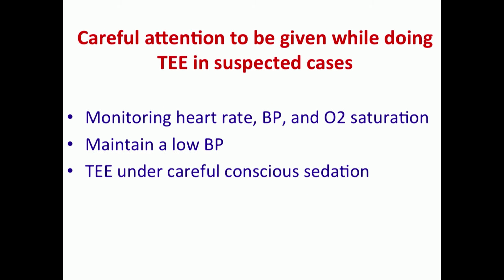And while doing the transesophageal echo, utmost care should be taken by monitoring the heart rate, blood pressure, and the oxygen saturation. We should maintain a low blood pressure while doing the transesophageal echo, because high blood pressure will cause further propagation of the dissection of the aorta, and TEE should be done under careful conscious sedation. The aim of conscious sedation is to get maximum cooperation of the patient with minimal agitation from the patient.